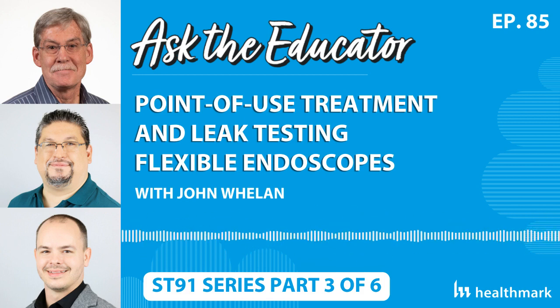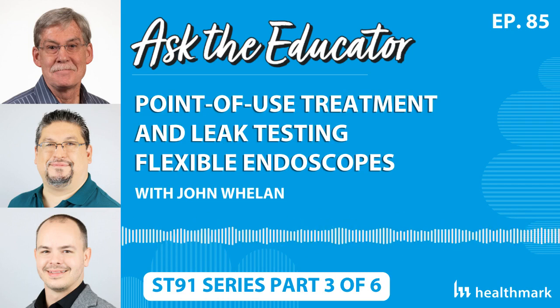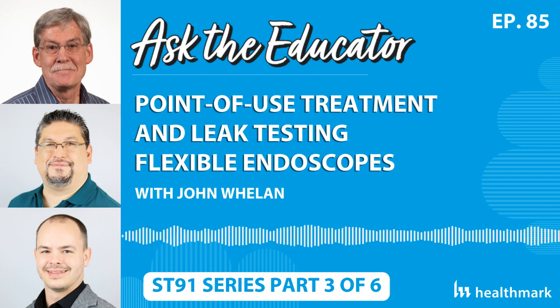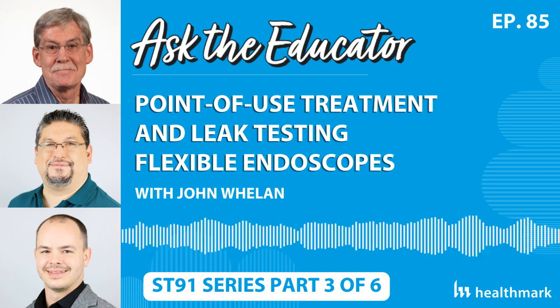Yep. So the only thing in follow-up to what you just said that I would reinforce to everyone is our practices need to be based on a combination of three different things: manufacturer's instructions for use, national standards and guidelines, and your own written policies. But your own written policies need to be based on IFUs and the standards and guidelines. So, for example, the direction for calibration of leak testers is not coming from the manufacturers, but it is coming from standards and guidelines. So you need to pay attention to that. Just because the manufacturer doesn't have it, it is in the standards and guidelines. So if you say you're an institution that's following AAMI ST91, then you need to have that in your practice.